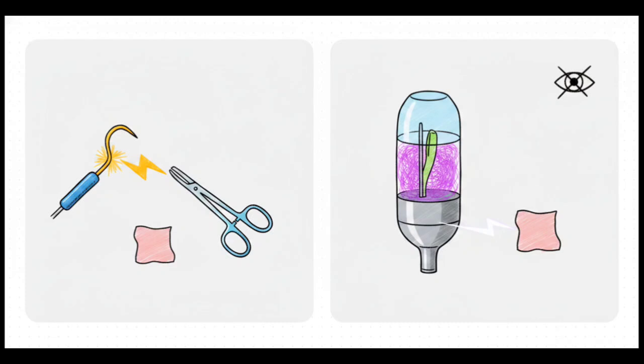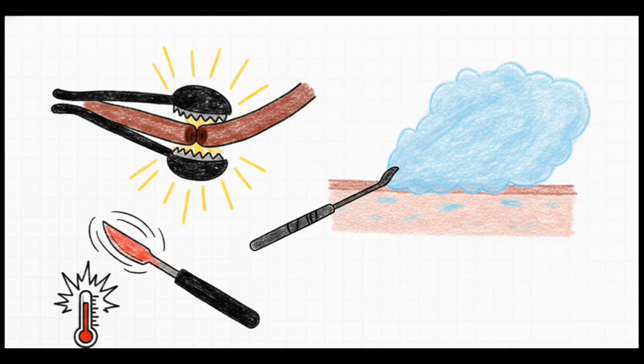The scary part? These unseen points of insulation failure can happen completely outside your camera's field of view, which can lead to absolutely disastrous delayed bowel burns. To mitigate those risks, we rely on specialized energy devices.